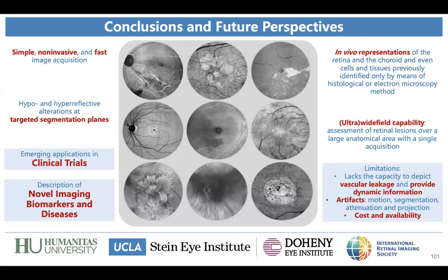So you told us that you use the Solix. I don't know if you have any material or information about the exchange about the different devices or hardwares. For instance, the Cirrus from Zeiss that I use, they call ellipsoid zone or EZ, ISOS.